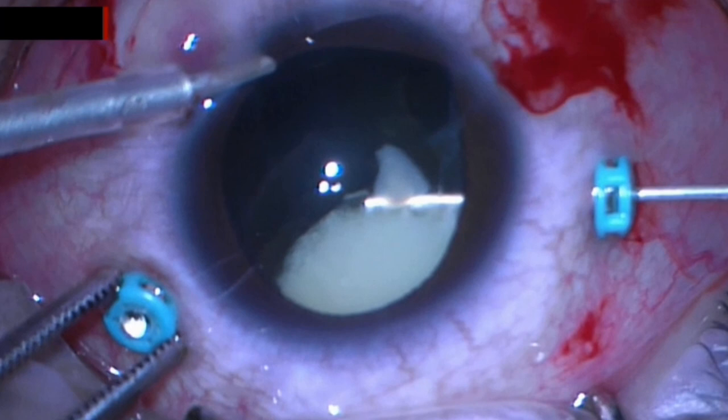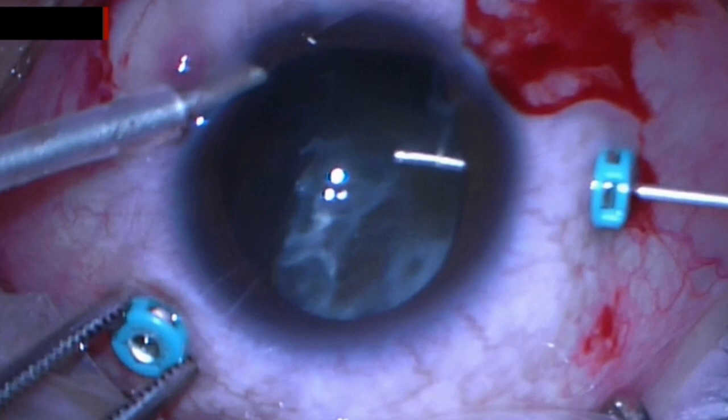In the beginning of the surgery, we can notice that the lens was very mobile. The surgeon started the procedure performing lensectomy using an anterior chamber maintainer due to the choroidal effusion.